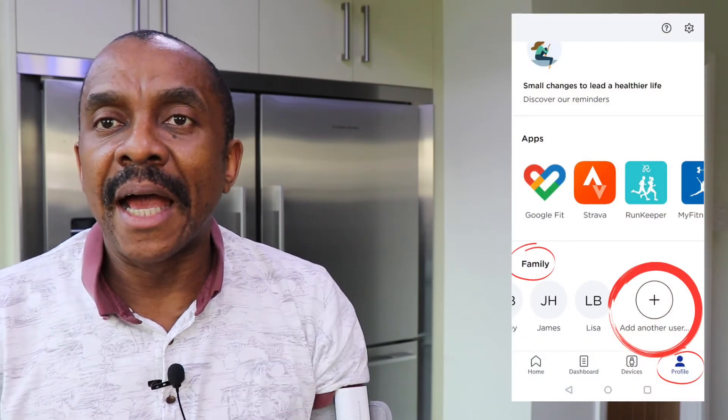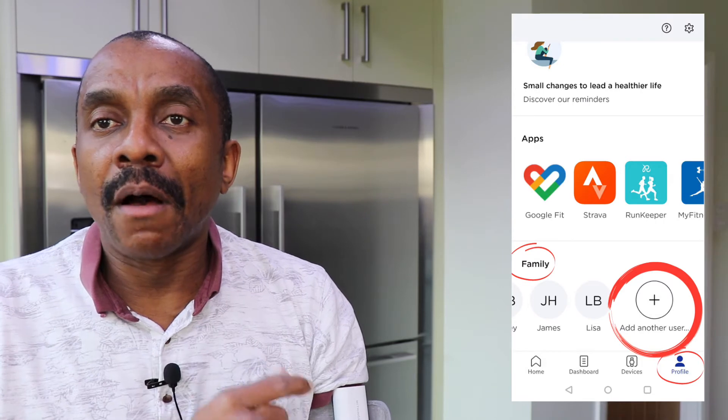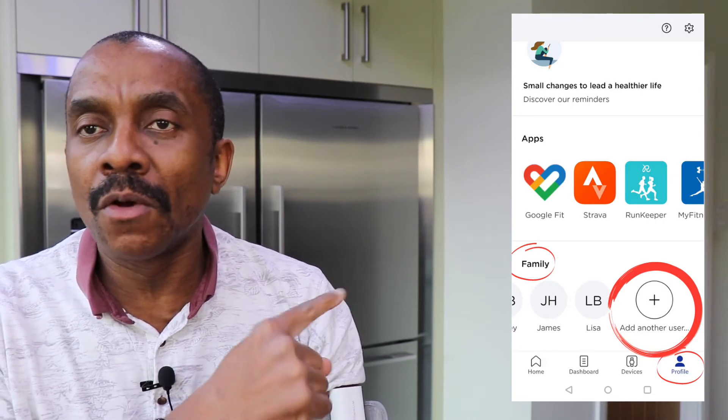If you want to share the app and set up other users, you can do that by touching the profile icon, which takes you to a screen where under 'Family' you can add additional users by pressing the circle with the plus button. That will ask you for the person's first name, last name, age, height, and weight, as well as their email address, which is optional. Once you enter all that information, the additional user will be set up.